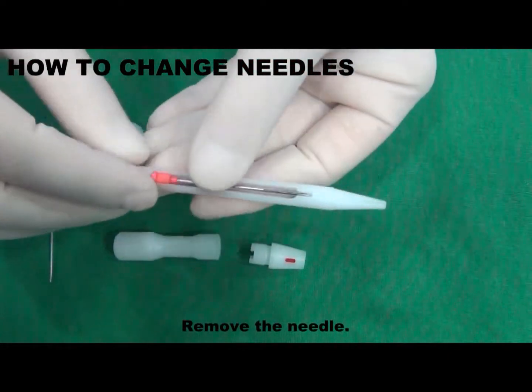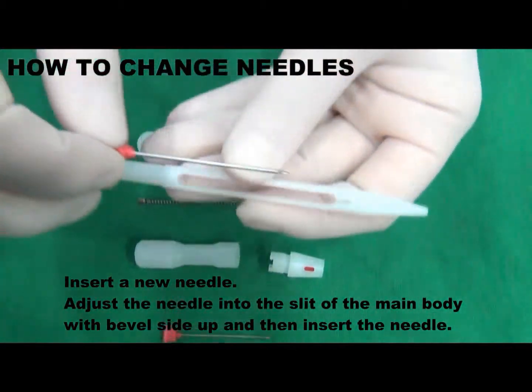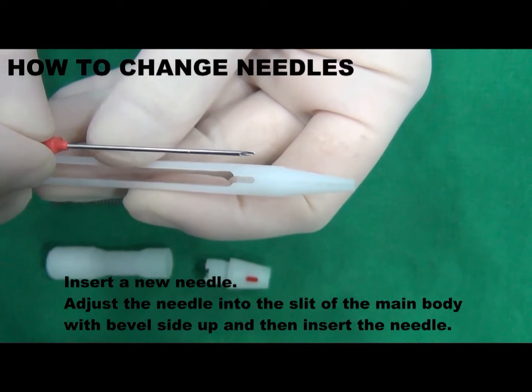Remove the needle. Insert a new needle. Adjust the needle into the slit of the main body with bevel side up, and then insert the needle.